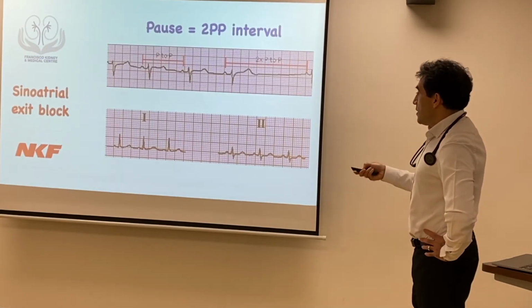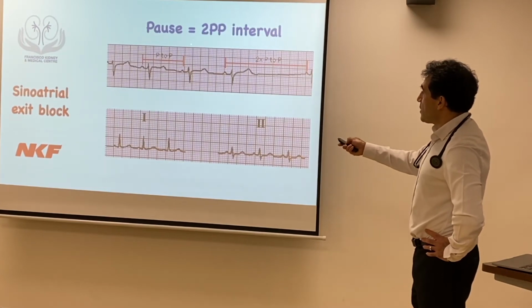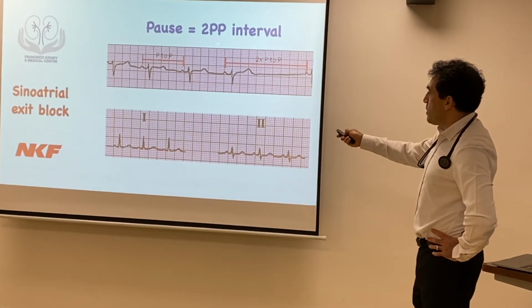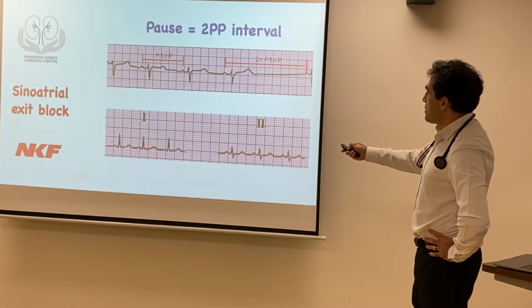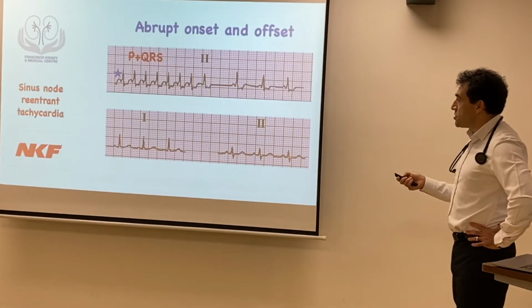There's another one, sinoatrial exit block. The pause is also 2 PP intervals. So there is a P wave here, there's a P wave, but there is nothing here. Just some examples.